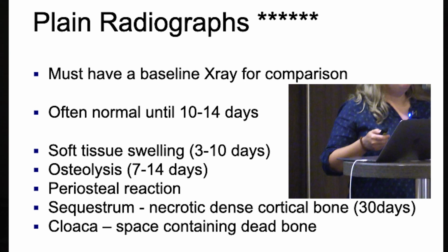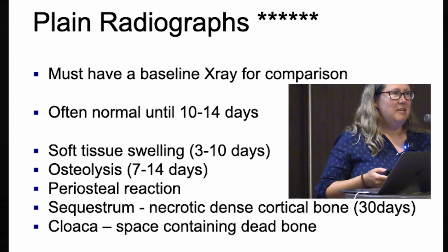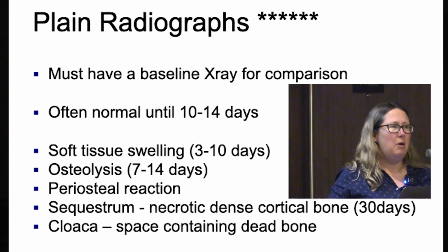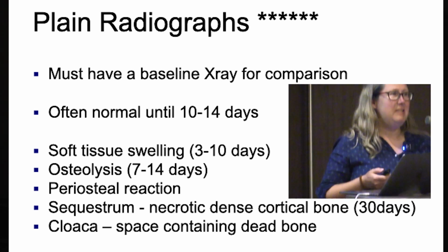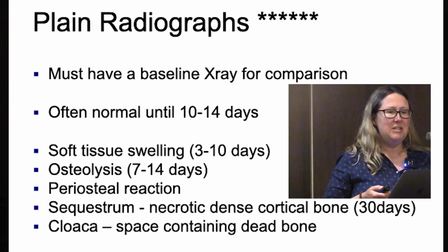So the one take-home message from today is X-rays. Everybody now piles in, they see an infection, oh, I'll order an MRI, I'll order a CT. Please, please, please, a plain film is key. You think it's too basic, but it's not.